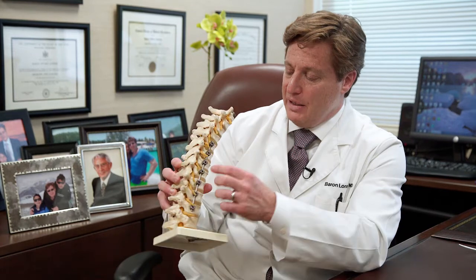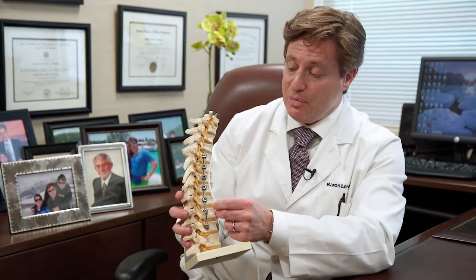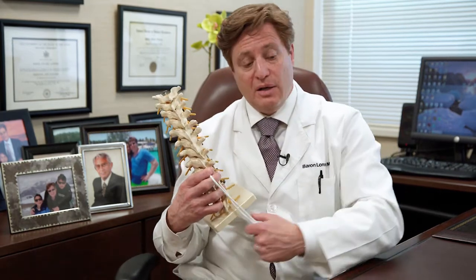We've been performing anterior scoliosis correction for 2 decades now. You can see here this model shows the placement of screws, and they go through the vertebral body here and they go across to the other side. And in early days of performing this, beginning 20 years ago, we would remove the discs and we'd place bone in their place. And then we'd place this solid metal rod. And we would do that in order to correct the spine and fuse it. What we're doing differently now is instead of the solid rod, instead of the fusion removal, we're actually using this flexible cord. And so this really is a dramatic departure and a change from what we had been doing in the past.